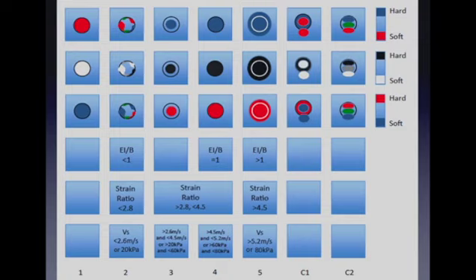I'd also like to show a table that I've made. I think that there are several methods that have been proposed to evaluate both strain and shear wave imaging. And I generated this table as one way of trying to pull all that information together and say that these are all looking at very similar properties, and it really shouldn't matter which ones we use because we should get the same results on either. The first 3 rows are actually the same technique where we're using the 5-point color scale.